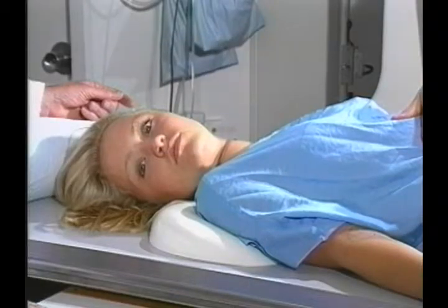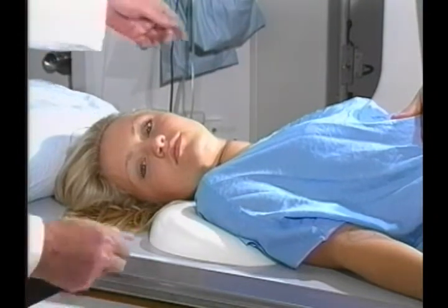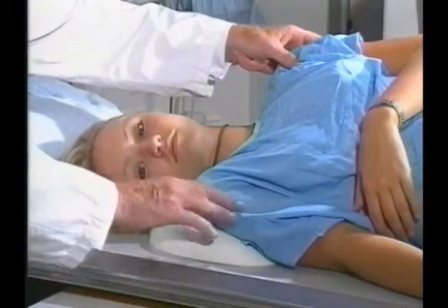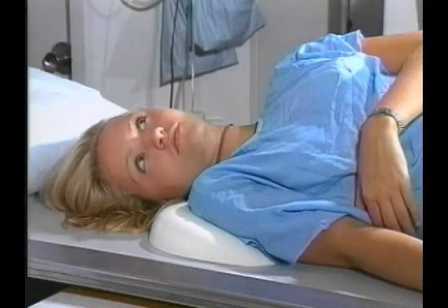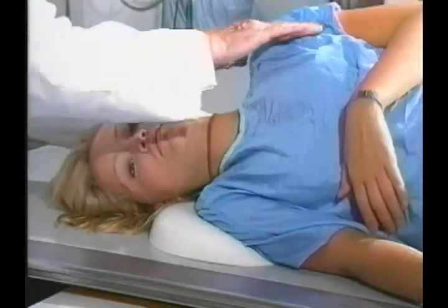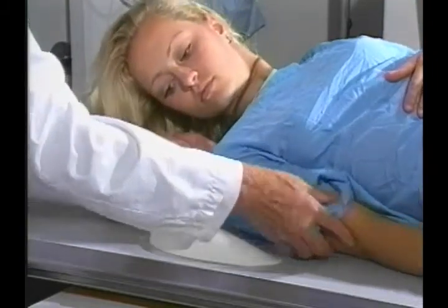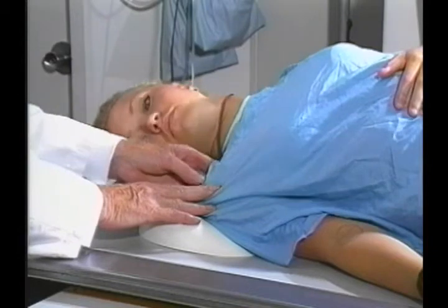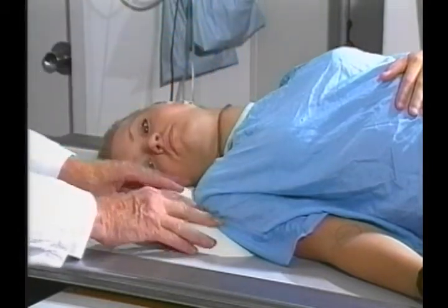Neer's view in decubitus is tricky because in turning the thorax, the shoulder does not follow and remains flat. We have to raise the whole thorax on a firm pillow and let the shoulder fall at 60 degrees. A CT scan is often preferable.